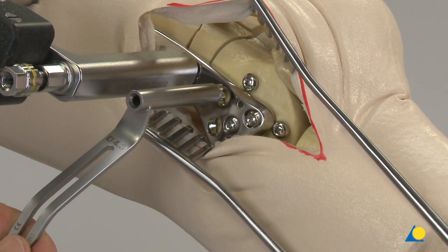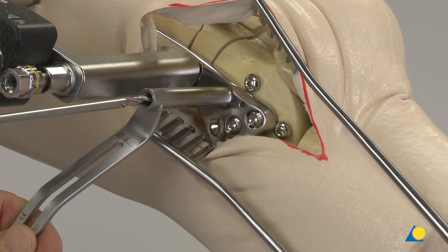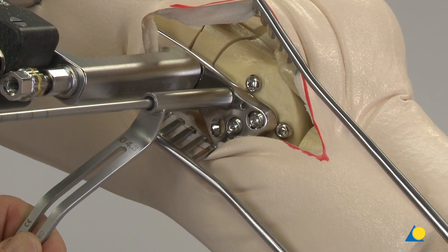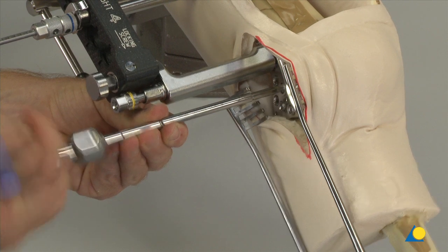The straight end of the variable angle double drill sleeve allows fixed angle drilling to ensure that the drill bit follows the normal trajectory of the locking hole. The screw is inserted using standard technique.